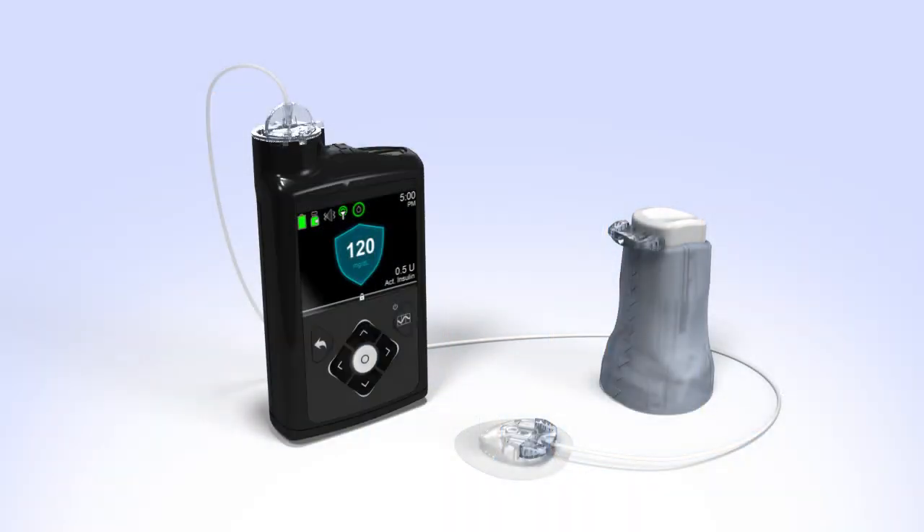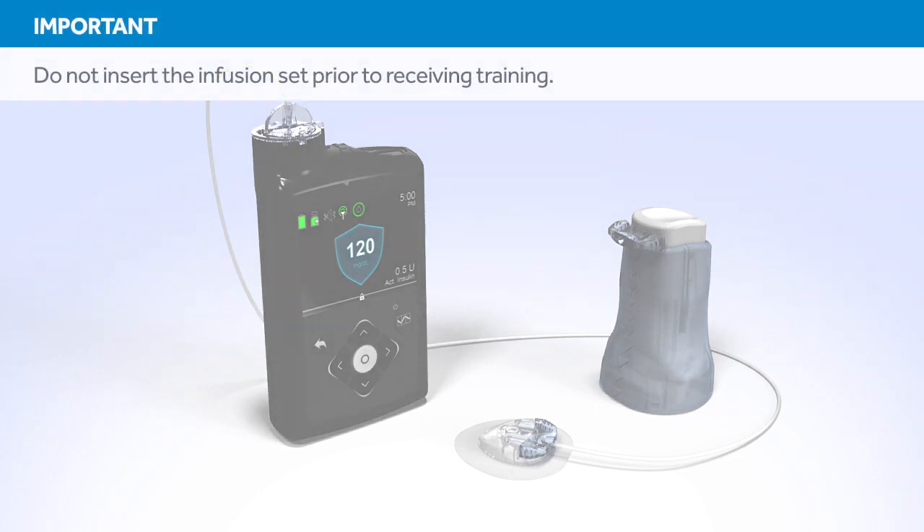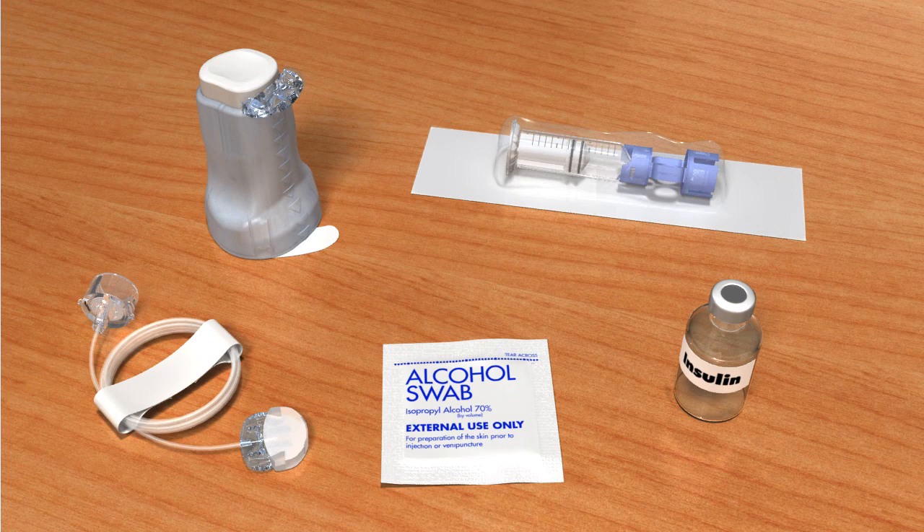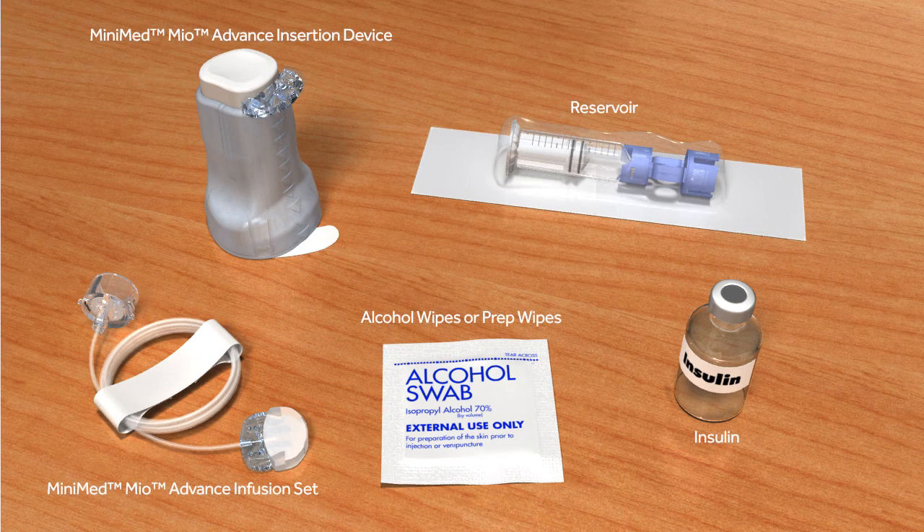Welcome to the Medtronic online training for changing the MiniMed Mio Advance Infusion Set. This course will show you how to fill the reservoir and insert the infusion set. Do not attempt to insert the infusion set prior to receiving in-person training. Before you begin, wash your hands and gather the items you will need. It is important that you follow the instructions as shown. Do not insert the infusion set until you have been told to do so.